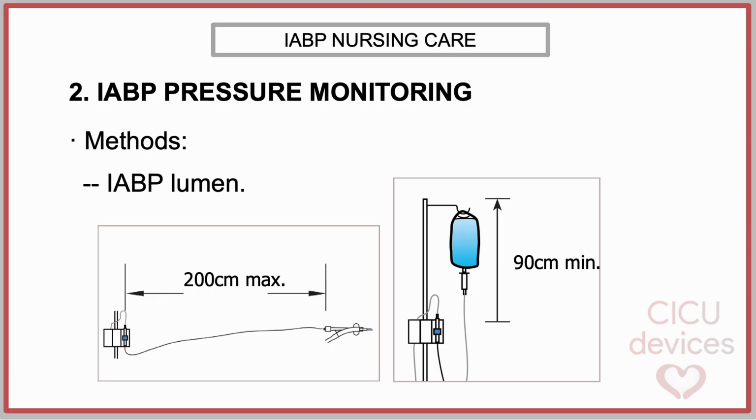to prevent blood reflux. The length of the pressure tubing should be minimized whenever possible to a maximum of 2 meters, as excessive tubing increases compliance and contributes to signal damping and delayed transmission. The continuous flush solution bag must be positioned at least 90 centimeters above the level of the transducer on a standard intravenous pole to ensure adequate pressure within the system and consistent forward flow.